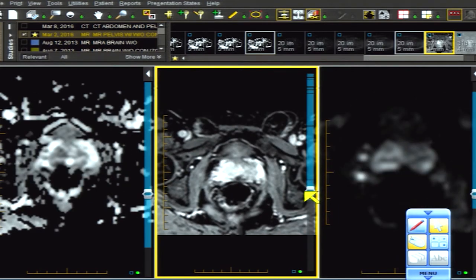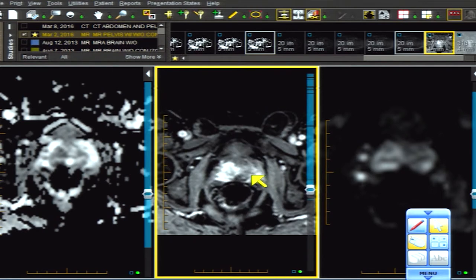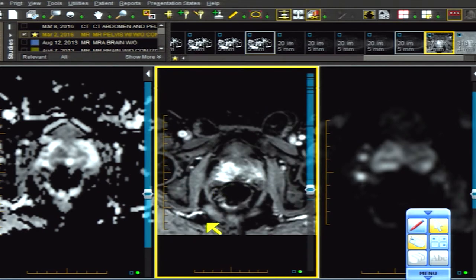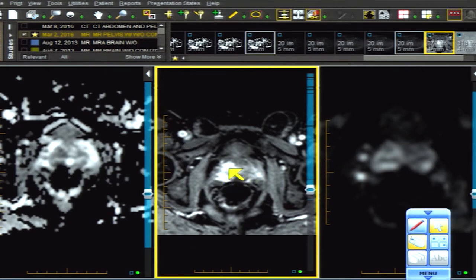Going really high, almost to the base: the mask and the seven-second image show where the most aggressive portion of the tumor is. That's where the ADC map is the darkest, the diffusion weighted image is the brightest, and the intensity is the brightest. That's where the infiltration through the capsule is the most pronounced and the most different from the rest of the gland. This is DCE MRI positivity — a diffusion weighted and ADC map PIRADS 5.